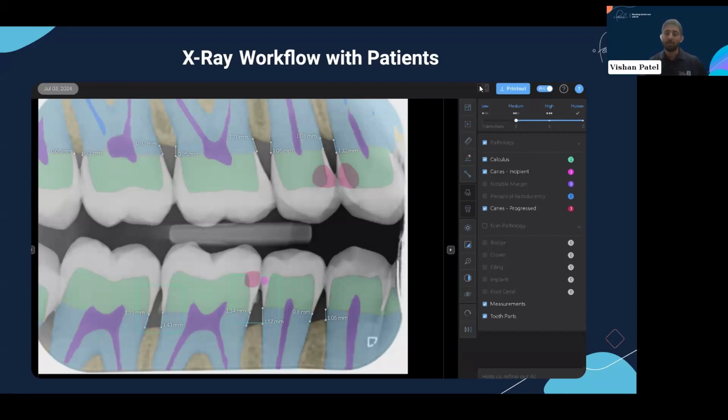Then you've just got to know that, and you've got to delete it or edit it essentially. But on X-rays like this, where you've got very clear teeth, I haven't had any issues. It's only maybe the canines that I've seen. It's added decay where there's clearly not decay basically. But that's only a few times really.